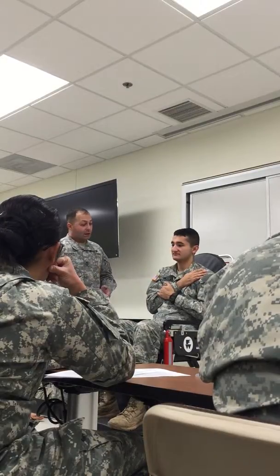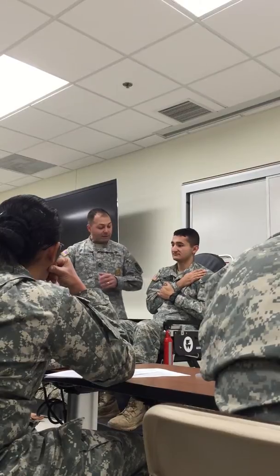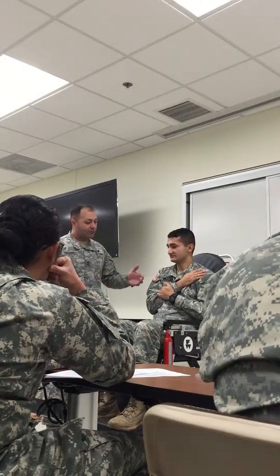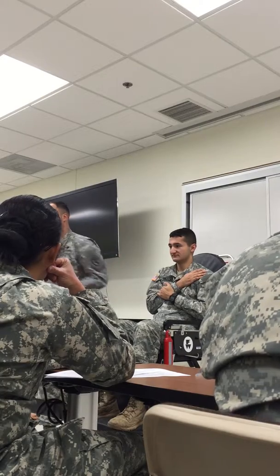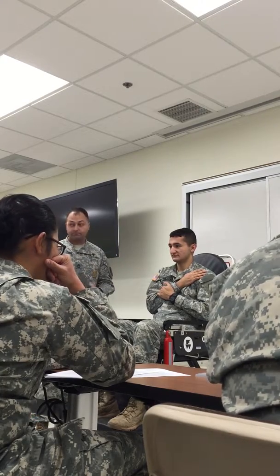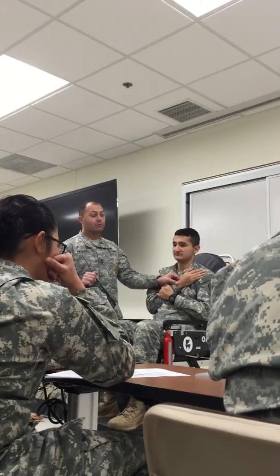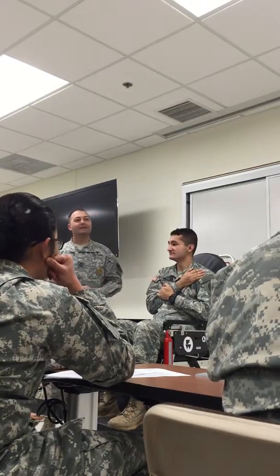Okay. So we finished our other 2 guys who came up. All right, buddy. I'm sorry it took me so long to get to you. Well, I'm gonna help you though. All right. So check the radial pulse. I'm checking the radial pulse and establishing that yes, there is a pulse. Wow, it's a big bounding pulse too.